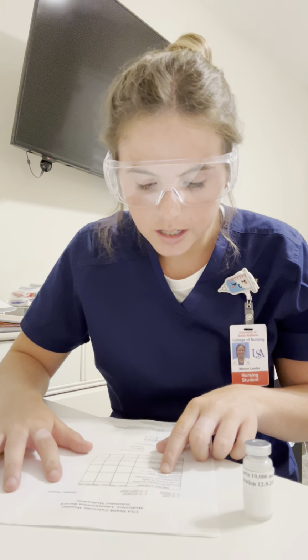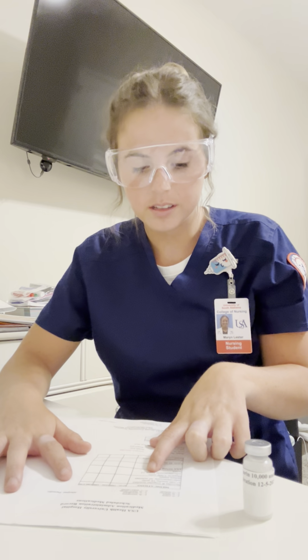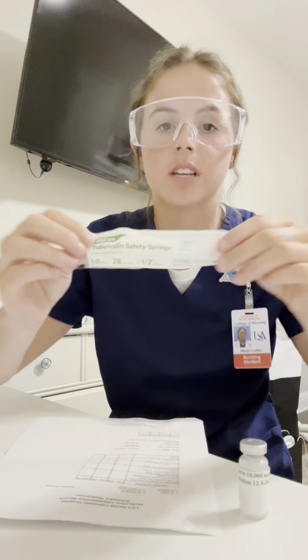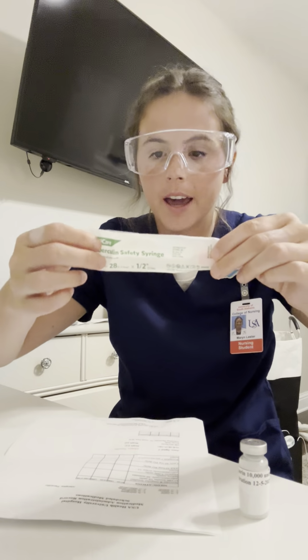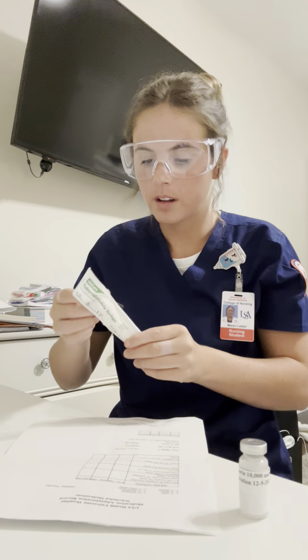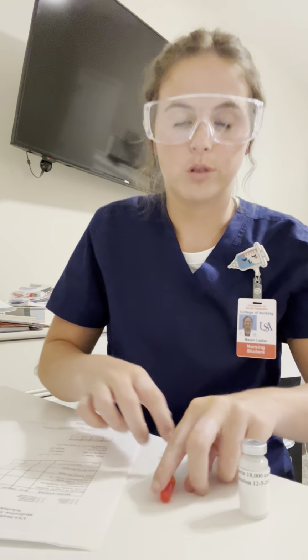So right dose is 5,000 units. So we're going to have to do some math. We have 10,000, so that'll be 0.5 milliliters, and I'm going to verify that with another nurse. Right route is subcutaneously, so I'm going to be using my tuberculin safety syringe. Okay. Right time is every 12 hours, so I'm going to make sure that I don't do it before 12 hours.